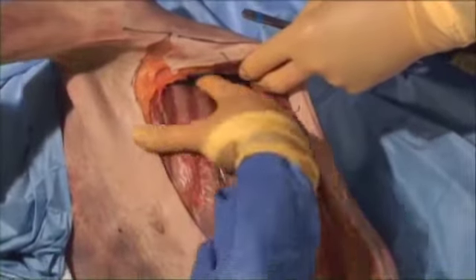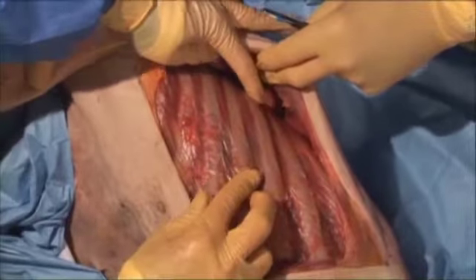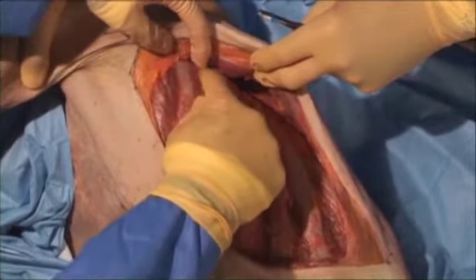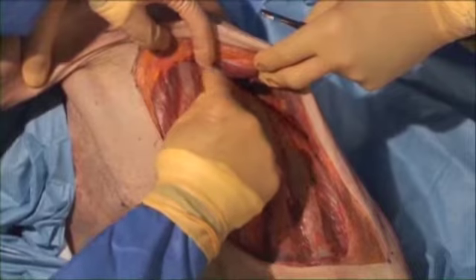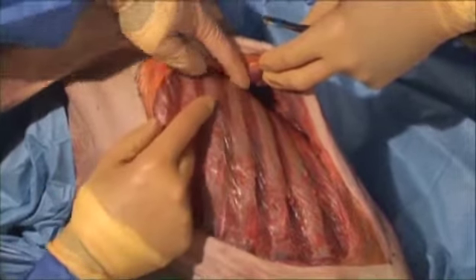Now, when you're working from the front to the back, as you get more posterior and you have fractures back here, these are the ones that would be ideal for a splint where you can create an entry portal here and work backwards towards the back of the ribs.